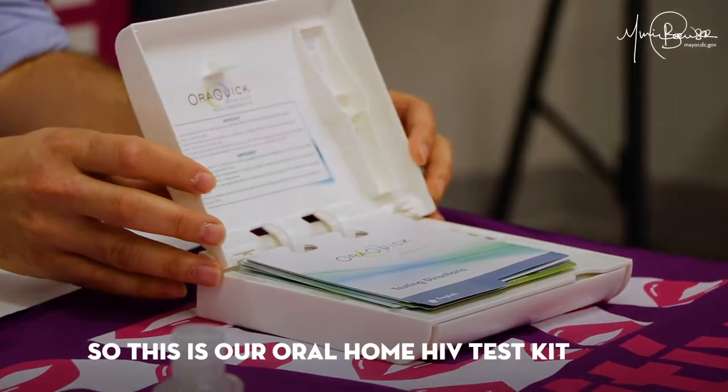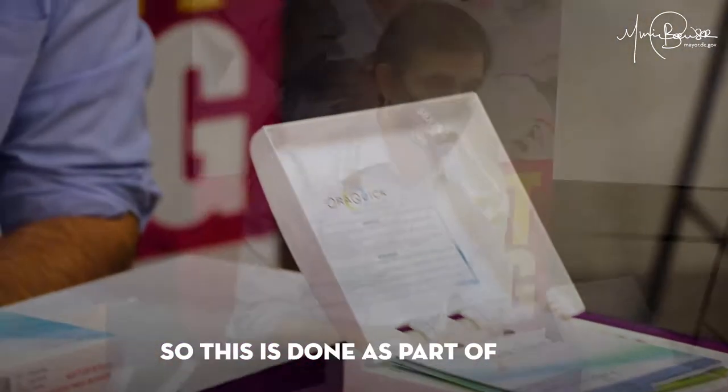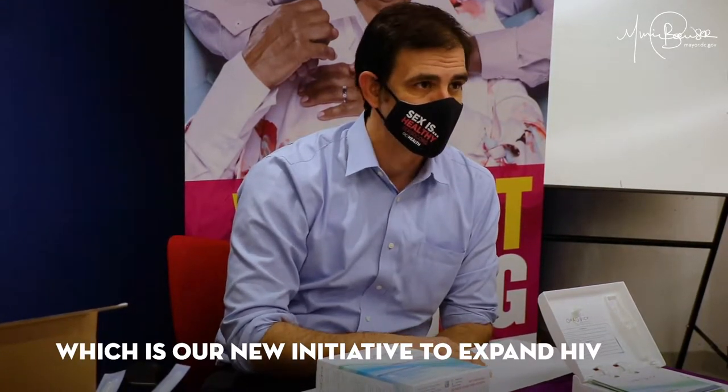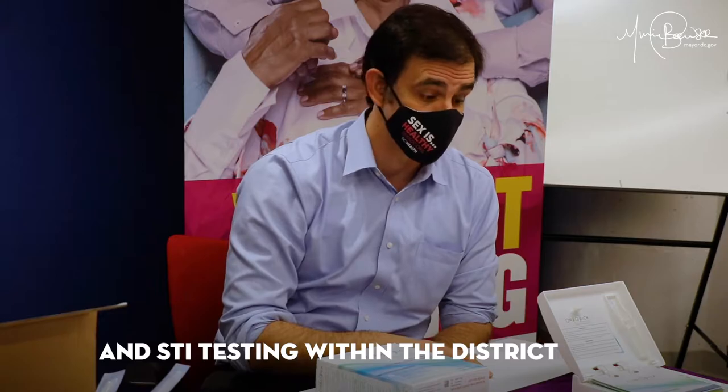So this is our Oral Home HIV Test Kit. This is done as part of GetCheckedDC.org, which is our new initiative to expand HIV and STI testing within the district.